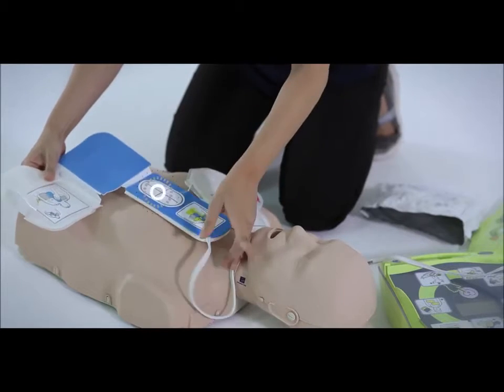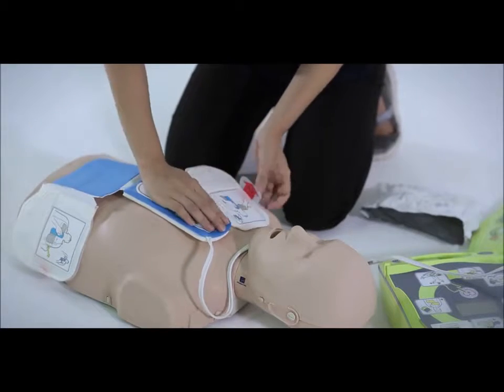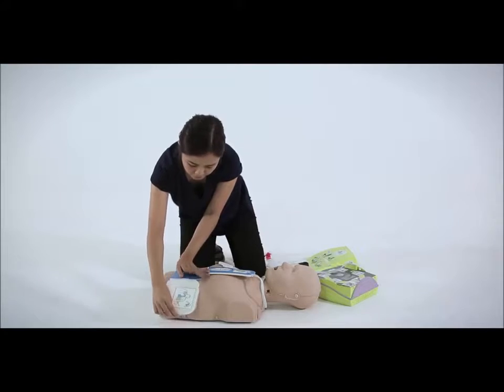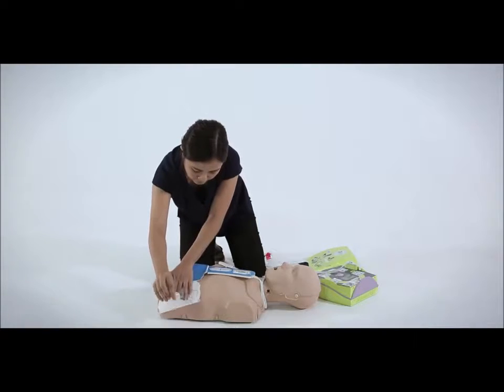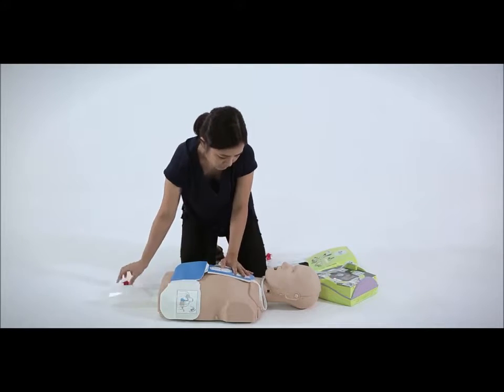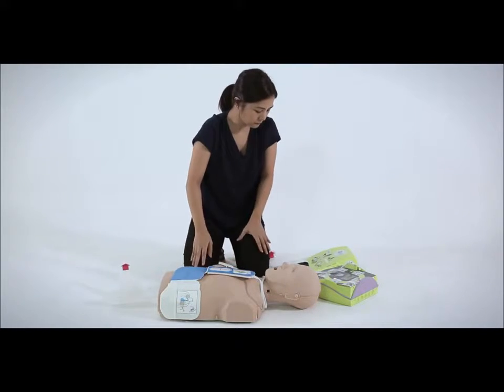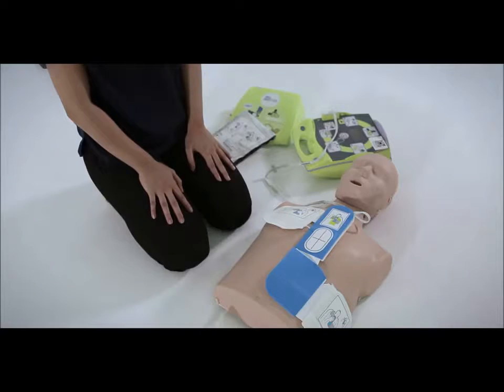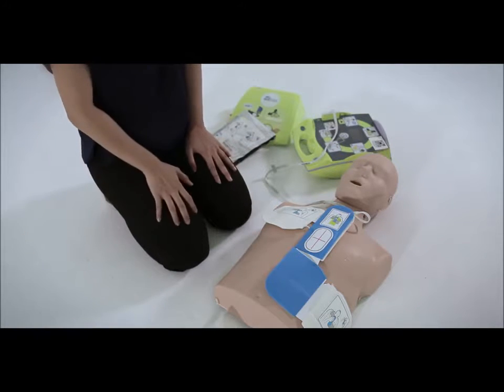Press the CPR sensor with your right hand and peel away the protective backing attached to the electrode pads. Press the electrode from the center out to make sure that it adheres properly to the victim's skin. Once the pads are applied, the AED will automatically analyze the victim's heart rhythm. You should not touch the victim at this point, and the AED will remind you not to do so.